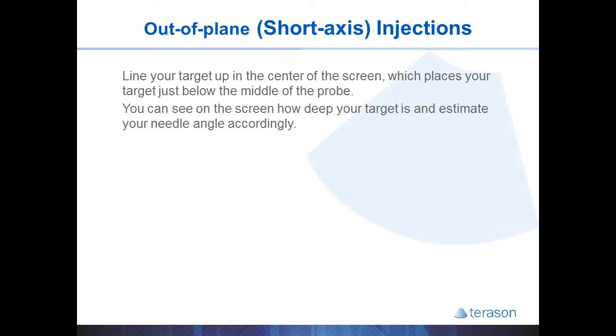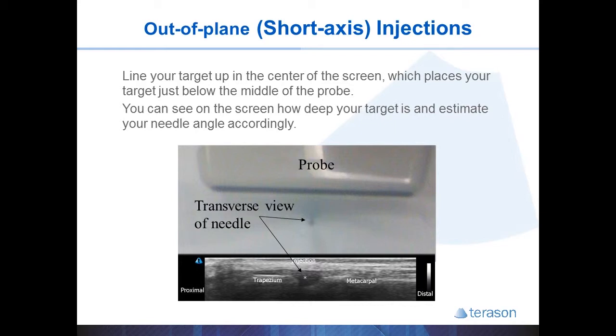You can use your depth markers to help gauge the trajectory of your needle. In this example, we see the probe, the needle on end, and the ultrasound image that it would represent. What you'll see is a white dot appear once the needle is under the probe. That would be a good spot to inject for this CMC joint.